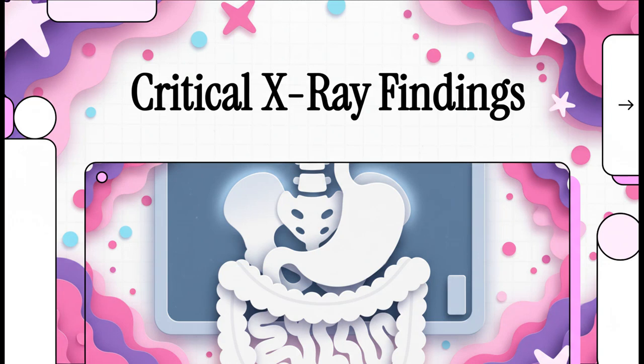Hello, everyone, and welcome. As future doctors, interpreting an abdominal x-ray is one of those skills you're going to use all the time, day in and day out on the wards. It's absolutely fundamental, so let's get you feeling really confident with it.